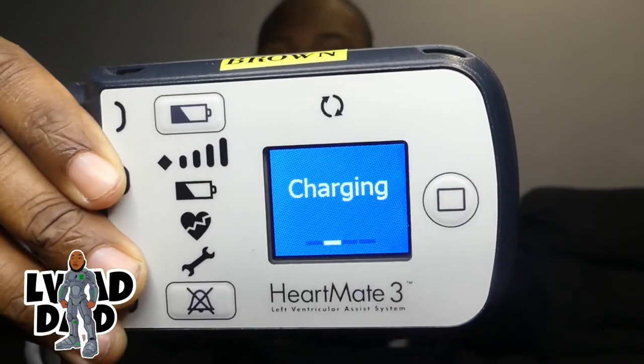You just take one of your batteries — doesn't matter which one — and you take one of your battery clips, you plug that in. Then you can take any cord and just plug it in. It is going to make a noise and you should see it light up. Just plug it in normally — and there we go, charging.